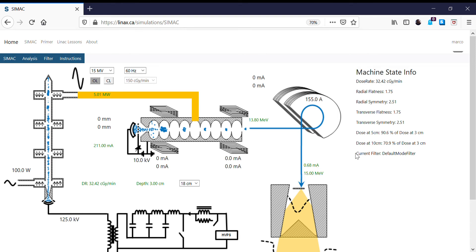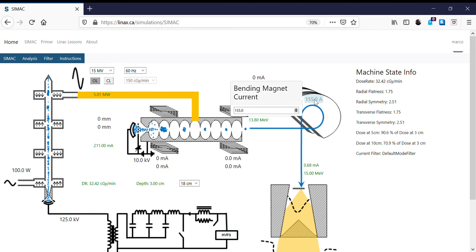So what I'm going to do now is decrease the bending magnet current. I'm going to go from 155 amps. If I decrease it, I'm going to allow a smaller energy to go through. So let's go from 155 amps down to 150.